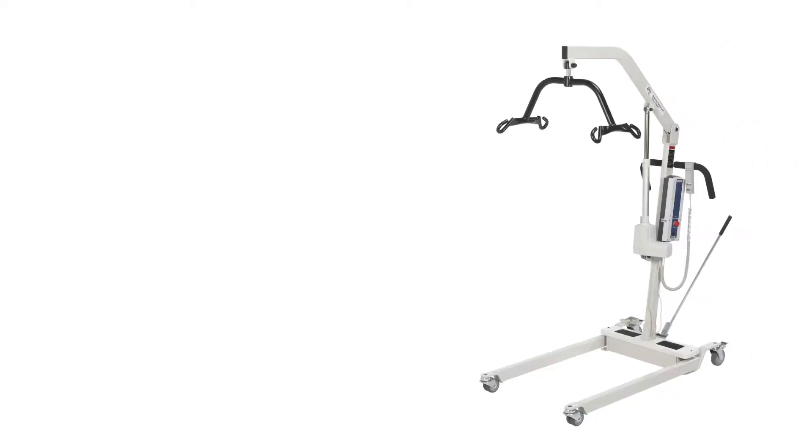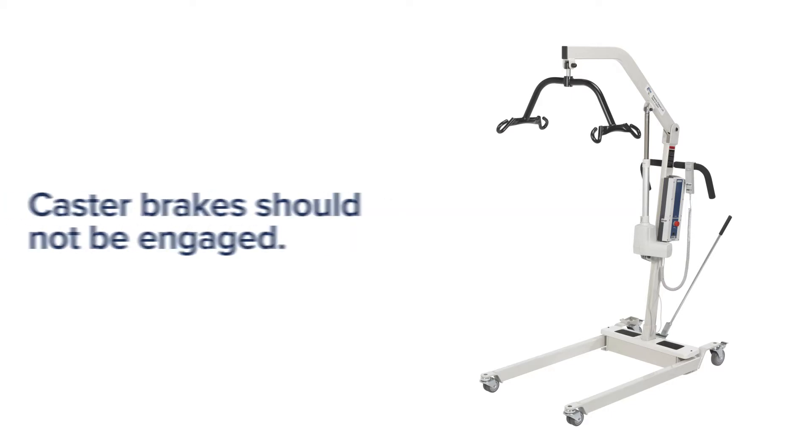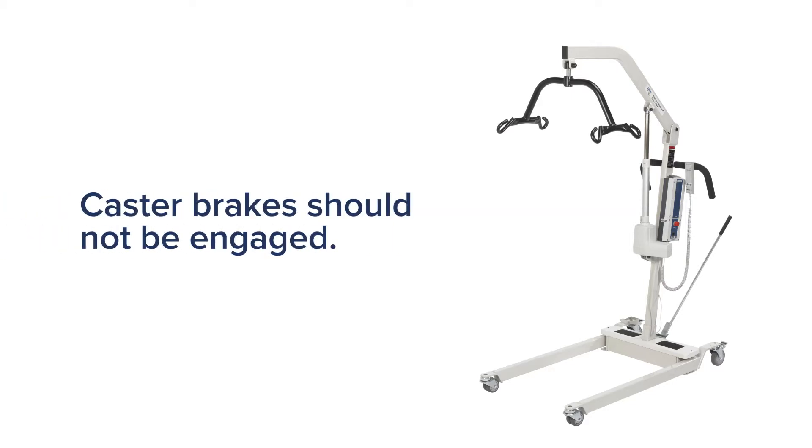Let's review some safety tips for operating the lift. The lift is used to transfer patients from bed to wheelchair or commode — please do not use it to transport patients. Always remember when lifting a patient, the base legs must be in the most widely open position and the caster brakes are not engaged. This will prevent tipping.